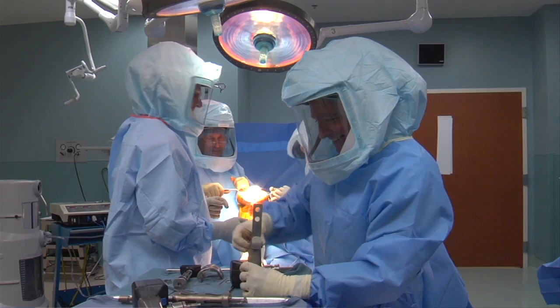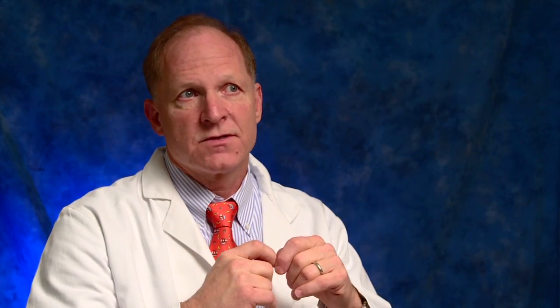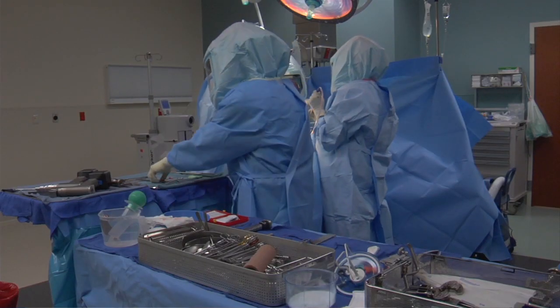We next use an instrument to cut the top of the tibia and we clean out the meniscal tissues. We try to save the ligament in the back of the knee, and of course we save the medial and the lateral collateral ligament — so we try to save three of the four ligaments. Then we prepare the top of the tibia to accept the components.